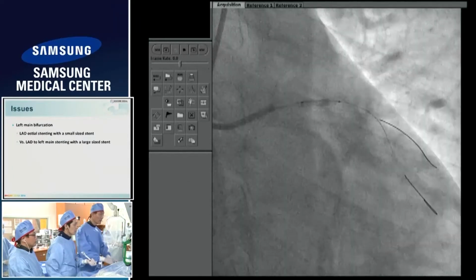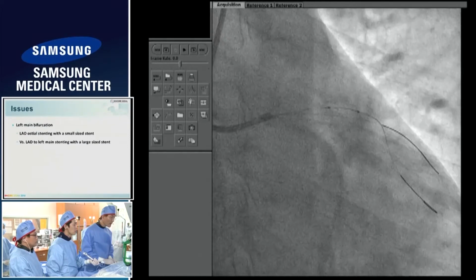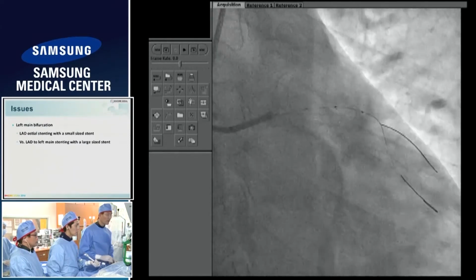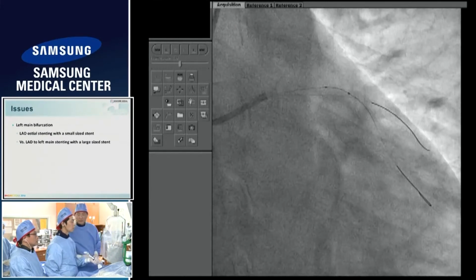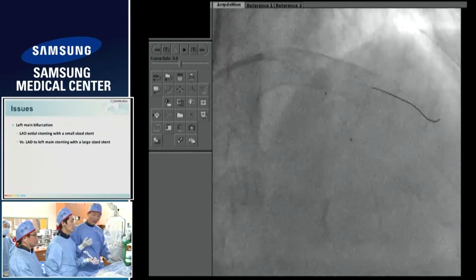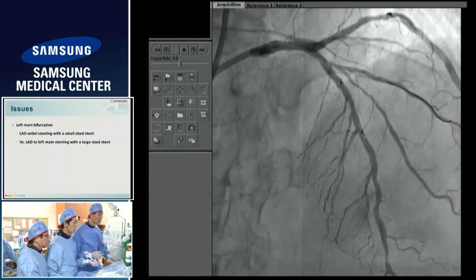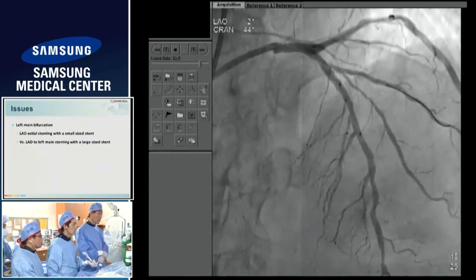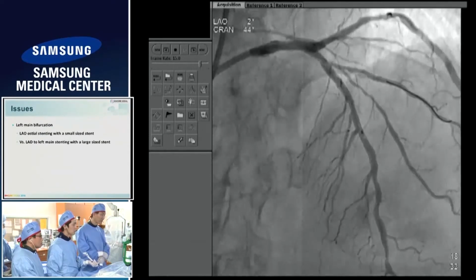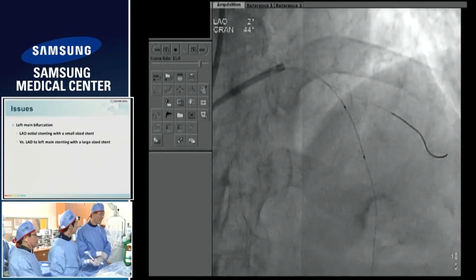Okay. So let's simulate the second balloon, second stent. I like to balloon marker on the screen, on the scaffold marker. You can see the 2 platinum markers on the BVS. So the option is 18 and 12, as you know. 12 is okay. Ostium looks pretty good.